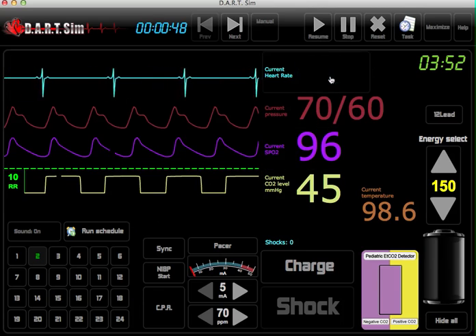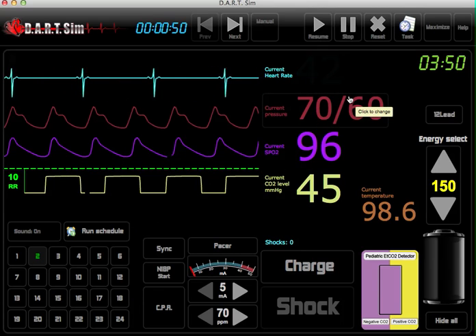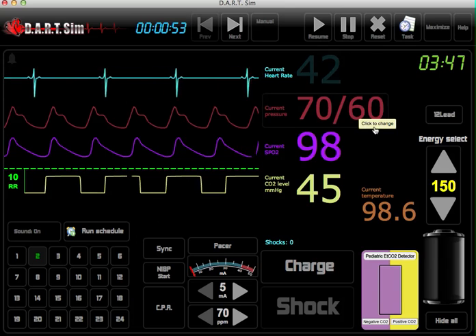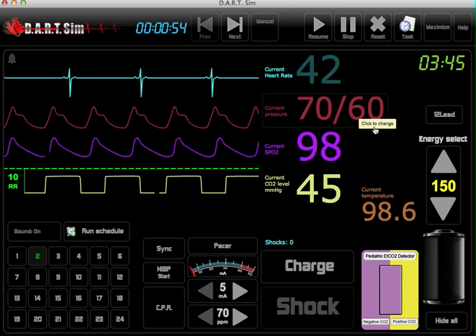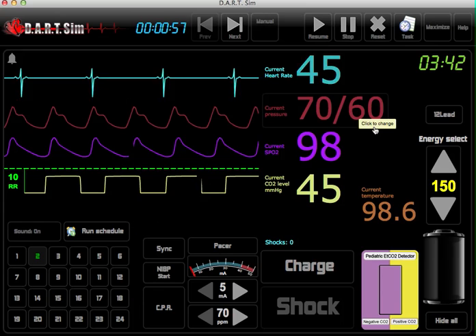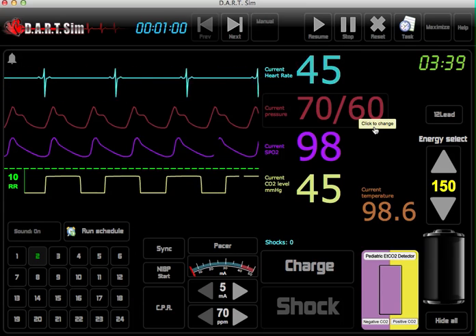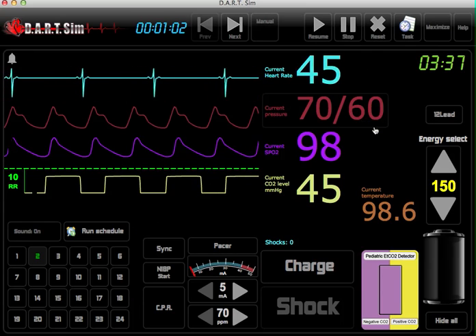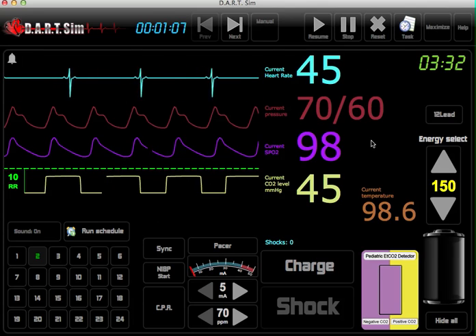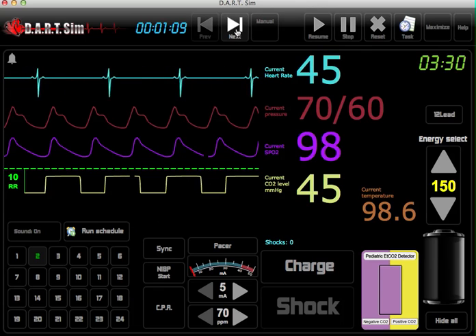You can also adjust the heart rate as well. Simply hold the H key and again hit the plus or minus to adjust that manually. If you want to advance to the next scenario, you can do that by just hitting the next button if your student is advancing well.